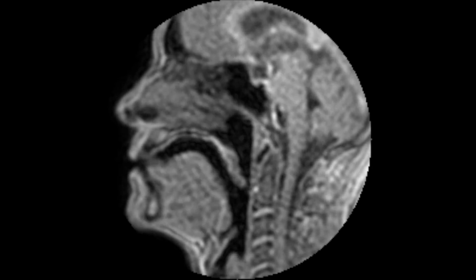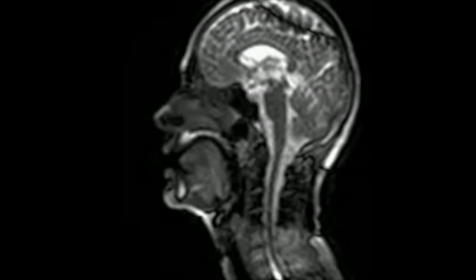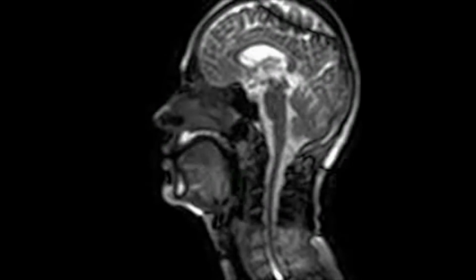A more recent suggestion to improve temporal resolution and image quality is to use what we call non-Cartesian sampling. Instead of doing line by line, we can do several other trajectories, like a radial spoke pattern or spiral interleaves, as you will also see in the example. Using those techniques, we can improve temporal resolution and image quality, but they are more complex to implement and more complex to reconstruct. So our work at the moment is to implement them in a way that can then be used for clinical assessment of the patients.